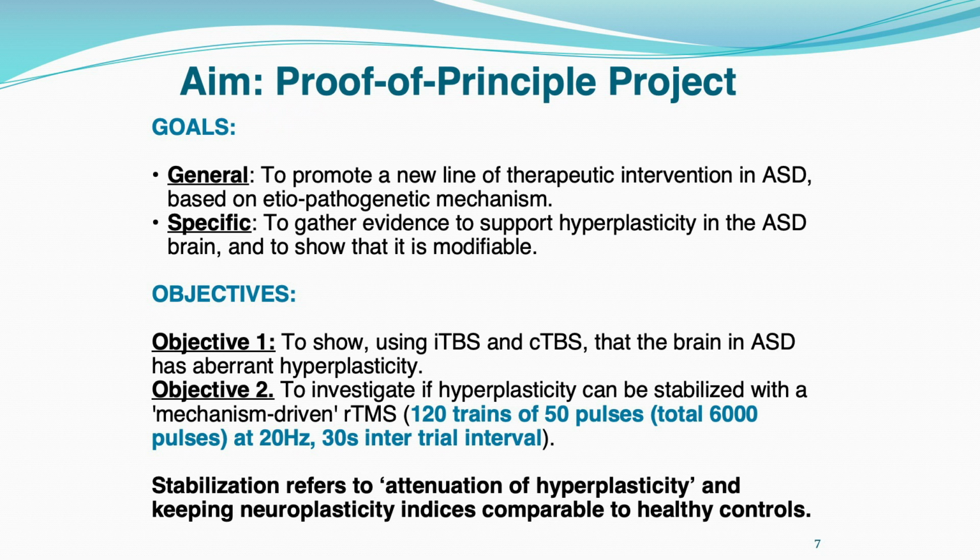And there is a second objective, where I'm applying another rTMS, repetitive transcranial magnetic stimulation, to see if we can reverse, or stabilize, the excessive hyperplasticity in autism.